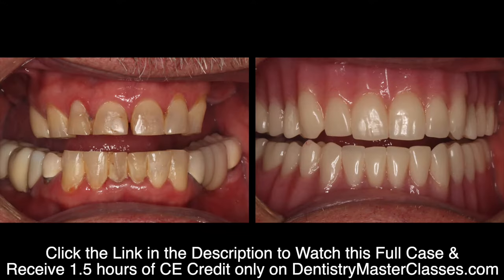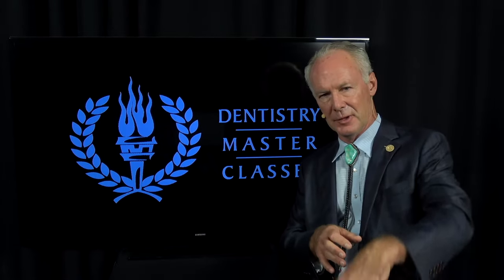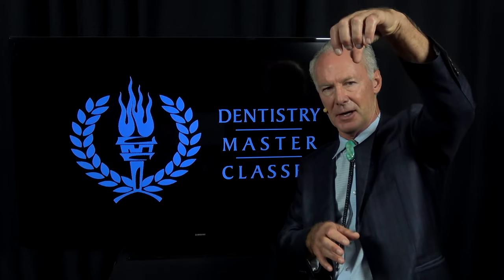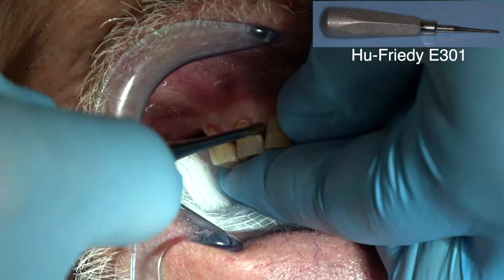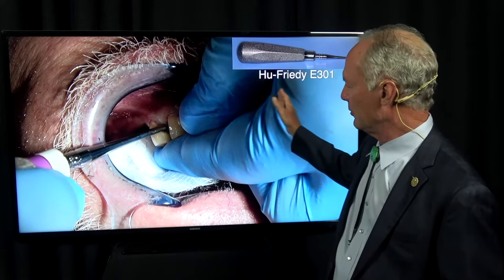Always try to elevate the teeth mesial-distally before you extract them, because you would like to extract the tooth straight out of the socket. Before I remove the teeth, always try to elevate them and just move them in the socket.